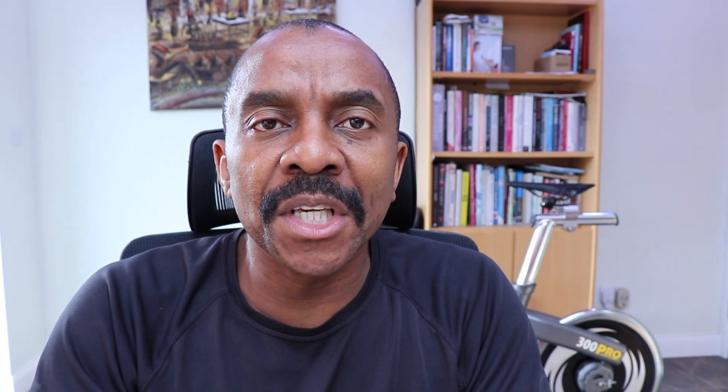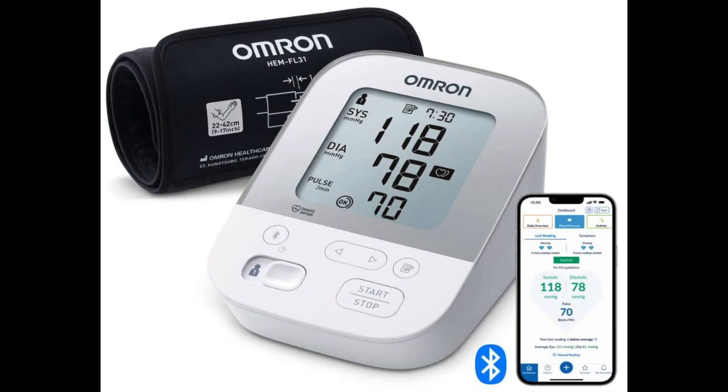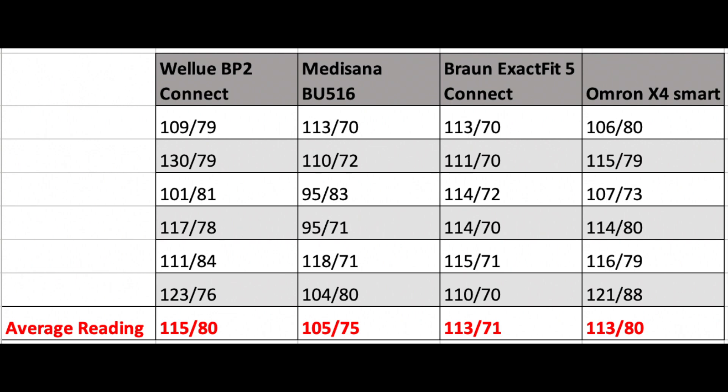I have had this blood pressure monitor for over a month and during this time I have been able to benchmark it against three other blood pressure monitors: the Medisana blood pressure monitor, the Braun ExactFit blood pressure monitor, and the Omron X4 blood pressure monitor. As you can see in the table shown, this WellU BP2 Connect compares very well with the other three, considering that all blood pressure monitors are calibrated differently by individual manufacturers.